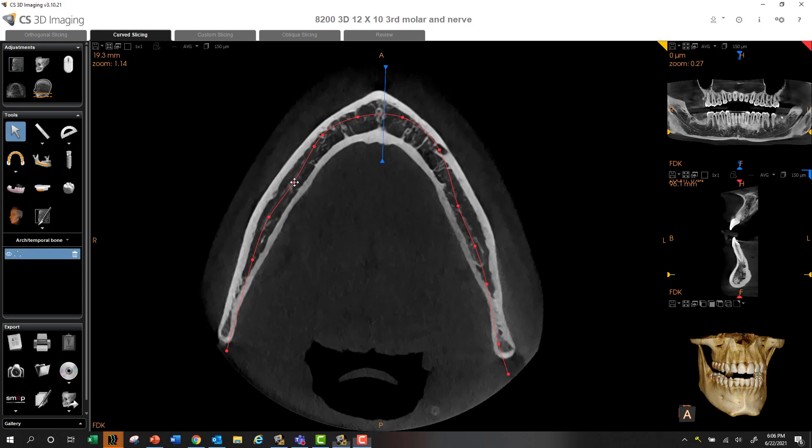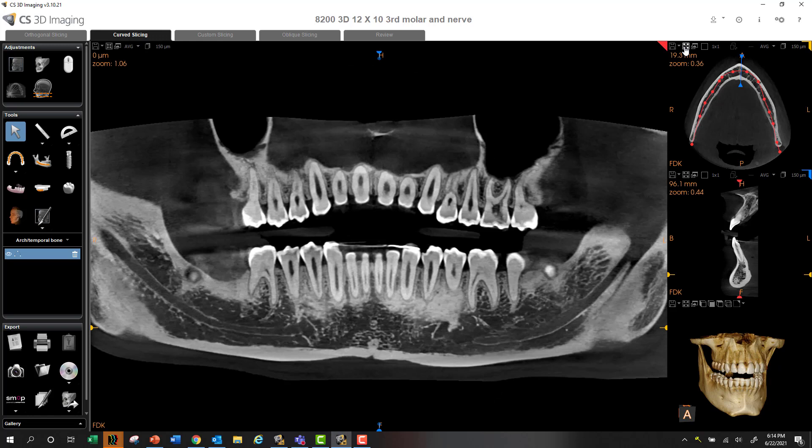Maybe I'll fix this just a little bit, and maybe on this side as well. But now what you're going to find is that the entire nerve is in full display without having to scroll buccal lingually. So it makes it a lot easier to map the nerve.